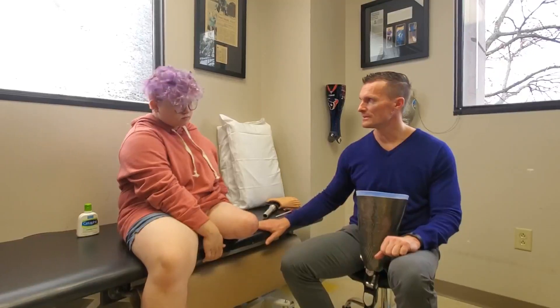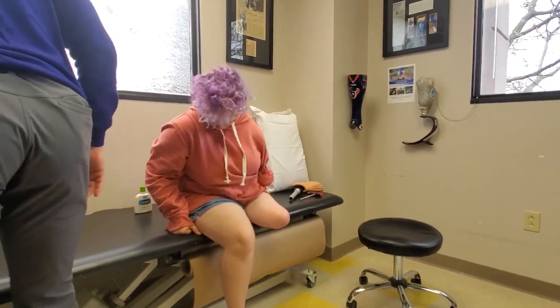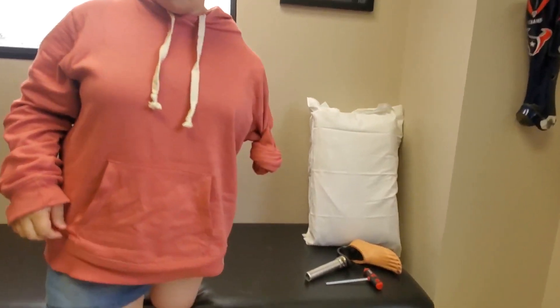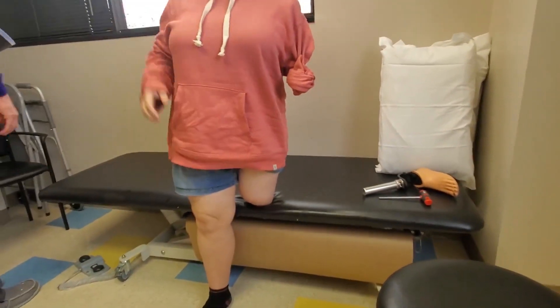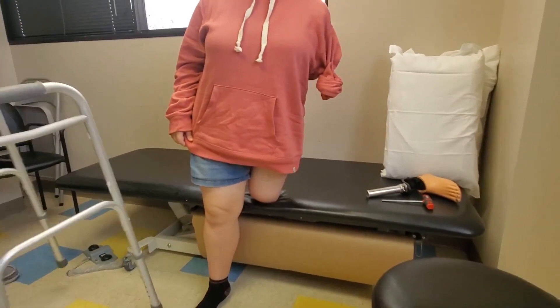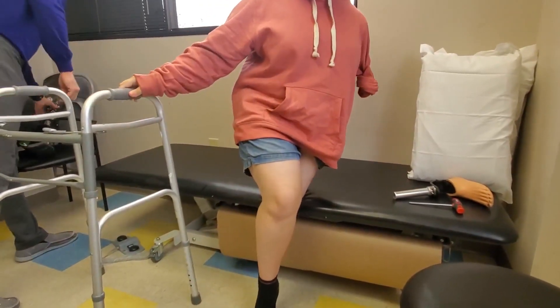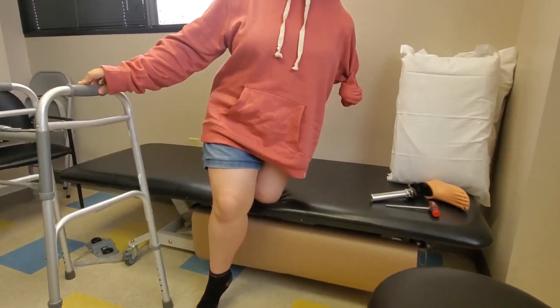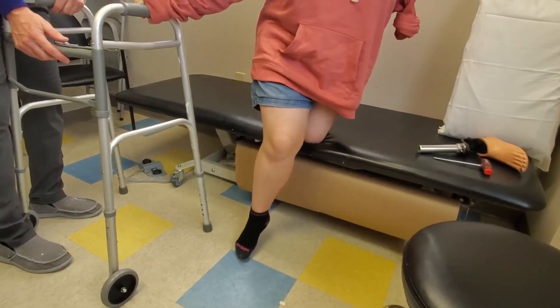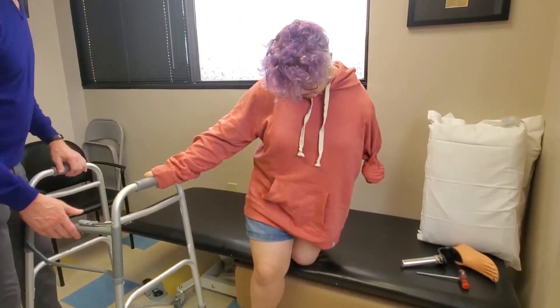You're able to put all your weight on the end of your leg, right? Let me let this down — stand up there and show them what we're talking about. Because this is a gold standard too: not only interval measure — put one hand here and just see if you can pick up. There you go, that's what I wanted you guys to see. You don't have any discomfort with that, do you? She has her femoral condyles, but with tibial hemimelia they are not fully developed, so it's almost more of one large condyle.